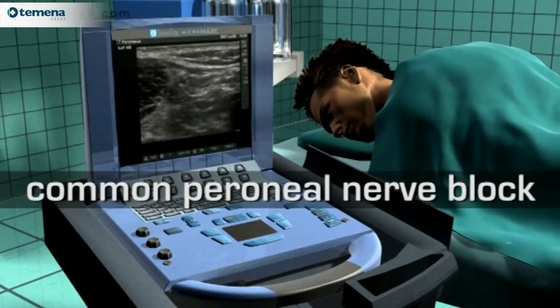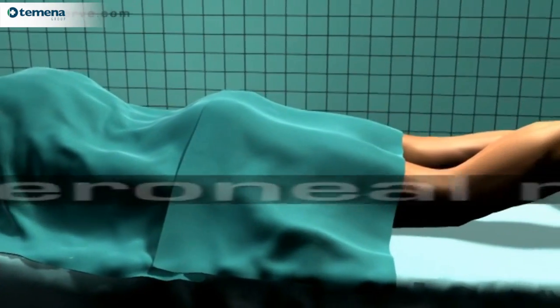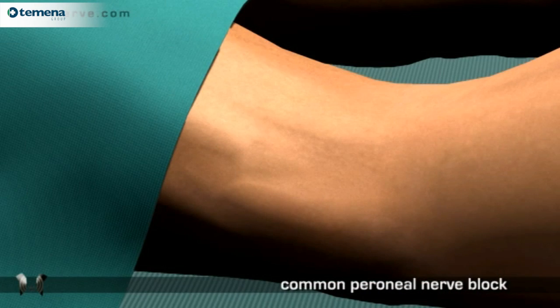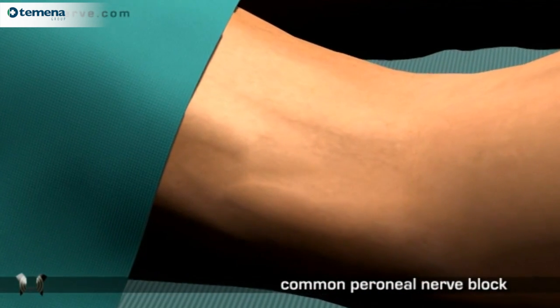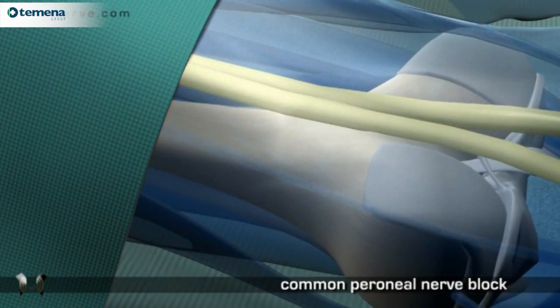Common peroneal nerve block. The patient is placed in the prone position. Supports are used so that the knee is slightly flexed. The common peroneal nerve is a relatively superficial nerve lying at one centimetre or less deep to the skin.